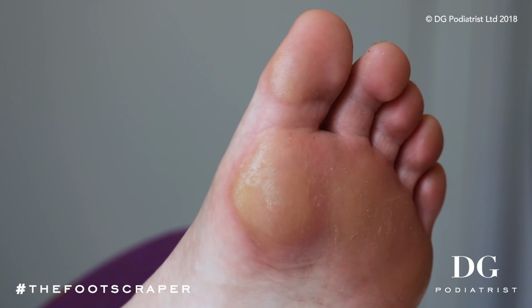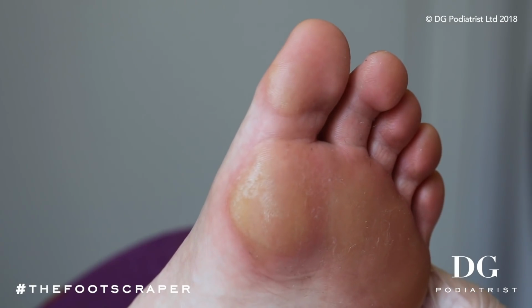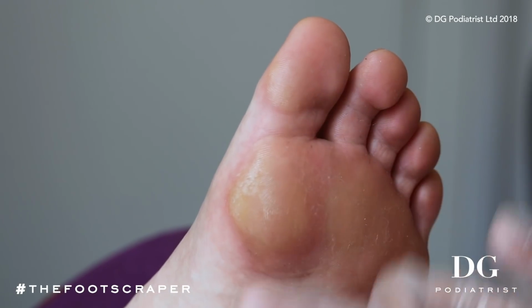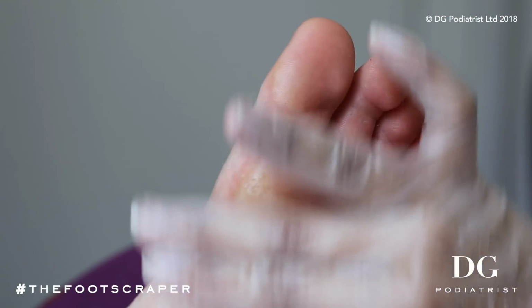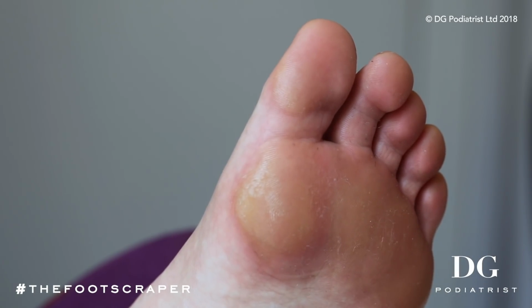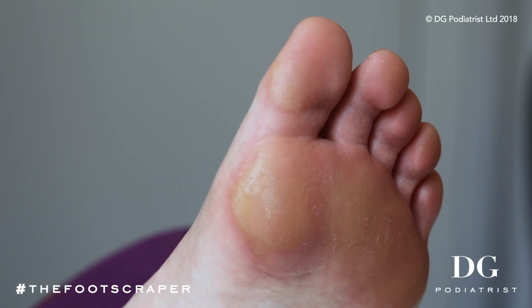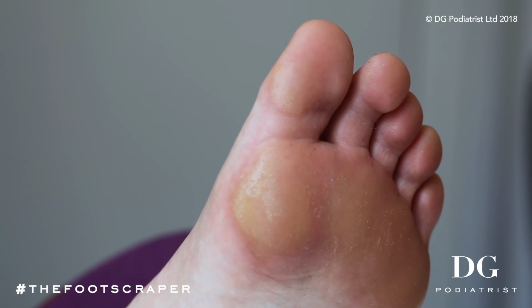So I'm going to talk you through a little bit more about what we're going to do today before we actually start. So it's going to be antibacterial just to cleanse the skin. Okay. And thereafter I'll be using a scalpel technique to remove the dead skin. Right. So it's going to be removed from here, and at the bottom there. If it's uncomfortable at any time, tell me and I can just change that for you. So we're going to start off with the antibacterial first and then we'll get to the fun stuff.